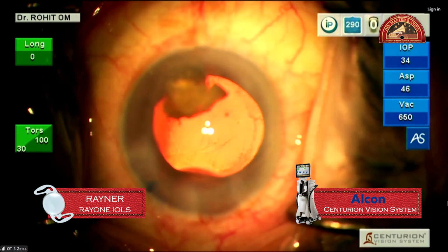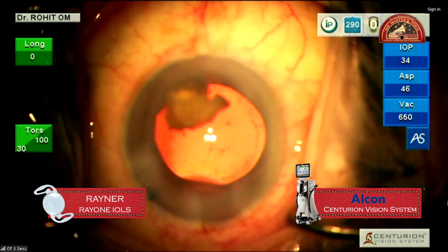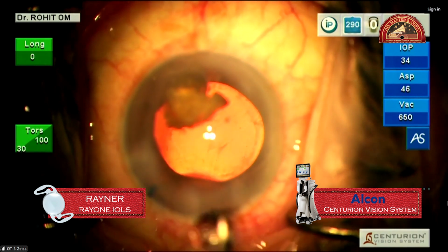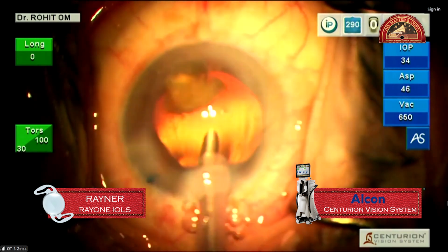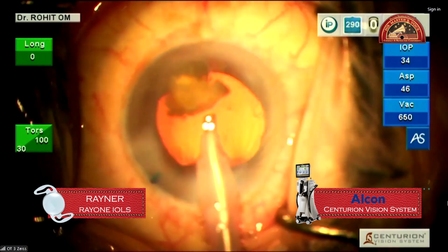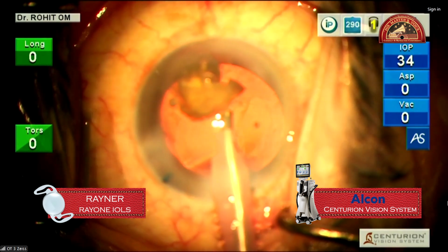So the trick to get a good separation is the trench which you do to bury it. That has to be deep so that you get access to the deeper core, just like Dr. Harshul was demonstrating, the central core which you create. The trick here is to get a good grip. So one of the clues is bury until the sleeve, the entire tip should be buried inside it. So no metallic part is visible, the entire 1.5 millimeter buried into the nucleus, then that ensures better holdability.